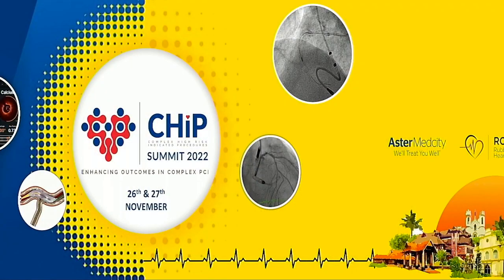No data as such. We have done 2 cases with an underexpanded stent where no other balloons were able to dilate it. But IVL, even in the first 20 shocks, just opened it up well, and it was well imaged too. Injury to the stents, as seen with ablation atherectomy, is not seen as such in IVL cases, but maybe long-term follow-up could be required in those cases.